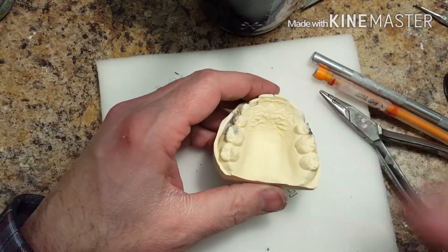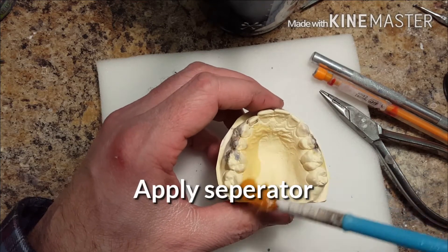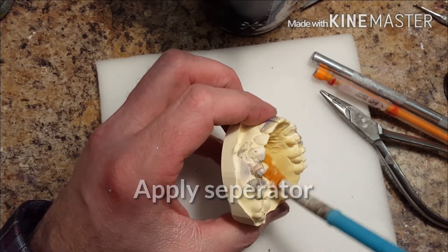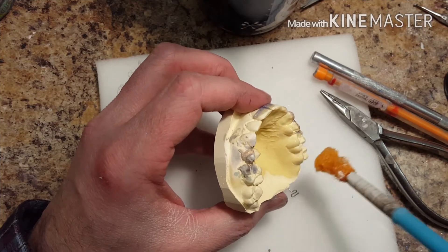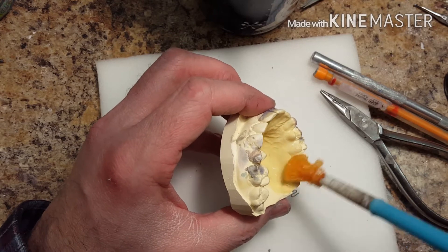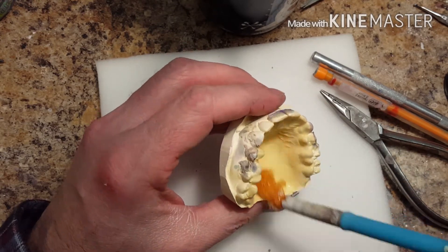Once this part's done, you're going to add some separator to the model. Where you're going to put the spring, just lightly put some separator, because you're going to wax it out and the separator is going to make the wax peel off. You don't want to bury it in separator — just put a nice little coating on it.